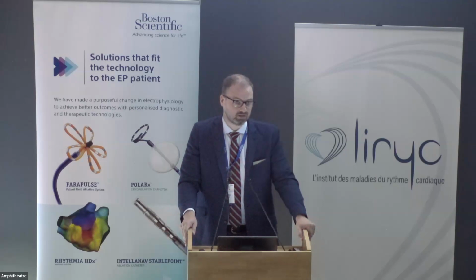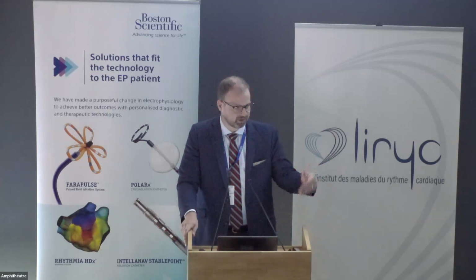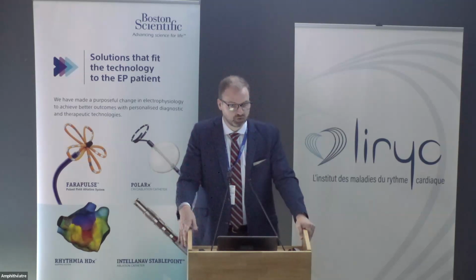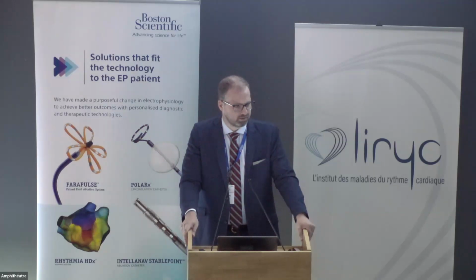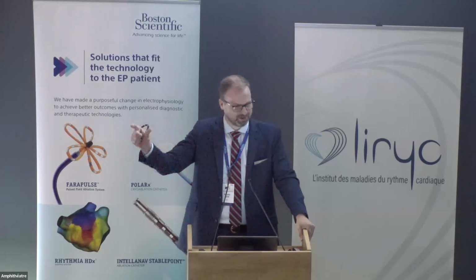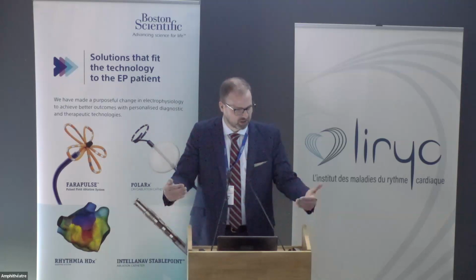However, maybe in the future, outside my control, the pulse width is one thing that is actually interesting, because companies are working on nanosecond. We've said publicly we're in the microsecond scale. You can go even higher than that. Those types of things I think may be of interest to people. I don't know if that will ever be public or not. I can tell you, when we derived our waveform internally and then compared it to the FARAPULSE waveform, we were shocked at how close we got to each other.